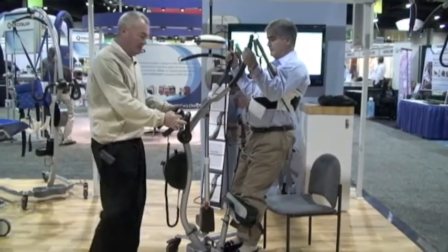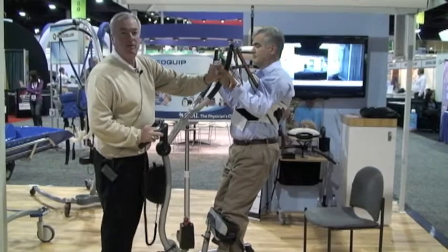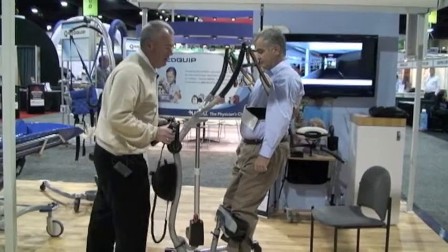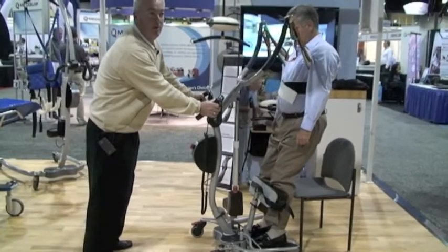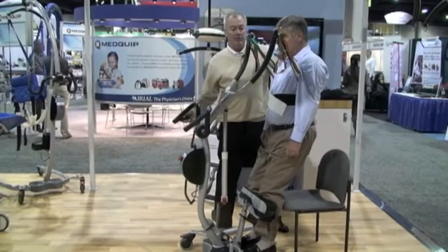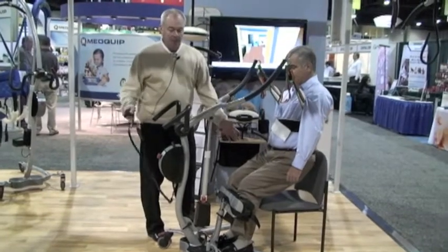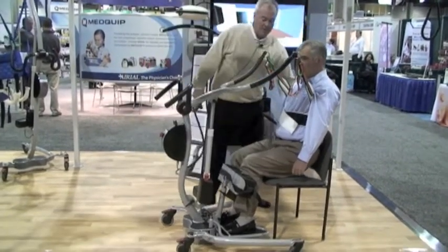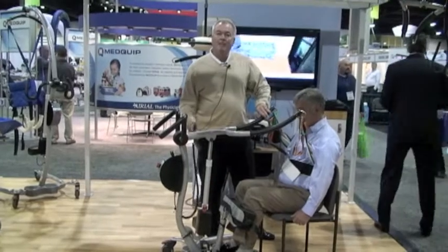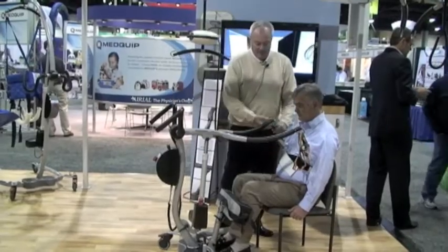When I'm done, I undo the brakes and I can bring this person to toileting or wherever I might need to go. At the same time, the patient can let go of their hands and maybe do some blood flow work. When I'm done, I'll bring the patient right back to the chair. At this point I don't need to put the brakes on. I'll position the chair and lower him down into it — as he sits into the chair, you'll see that the lift will come out. And we got him right back into a nice sitting position. This is the Stella Sit-to-Stand Lift with Ergoette.